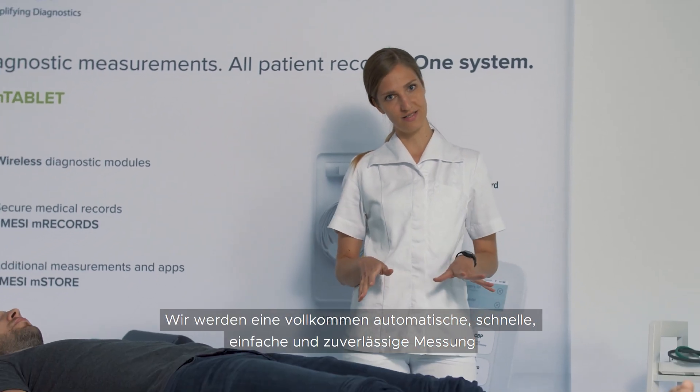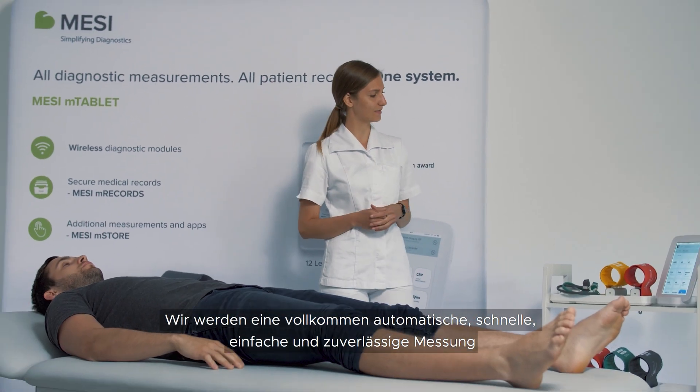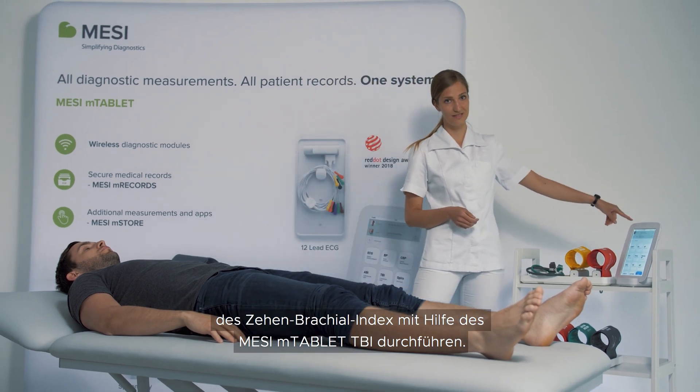We will perform a fully automated, quick, simple and reliable measurement of toe brachial index using mTablet TBI.